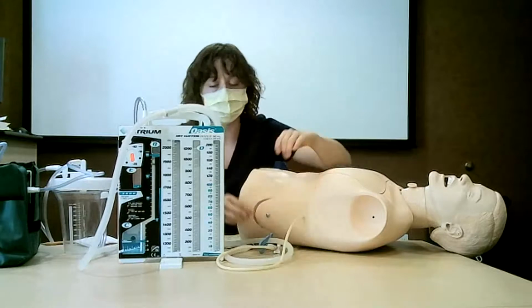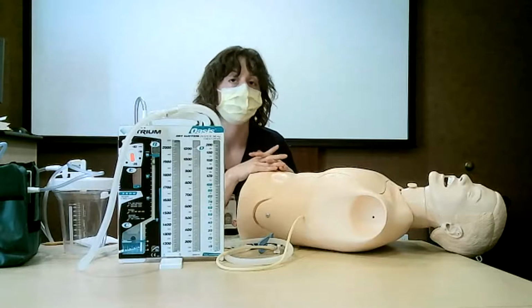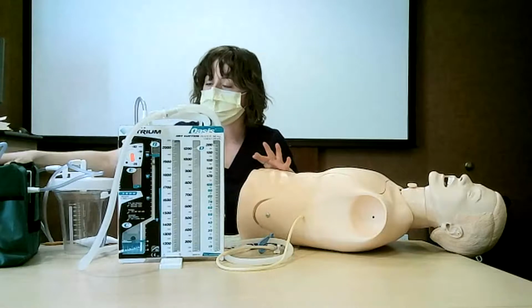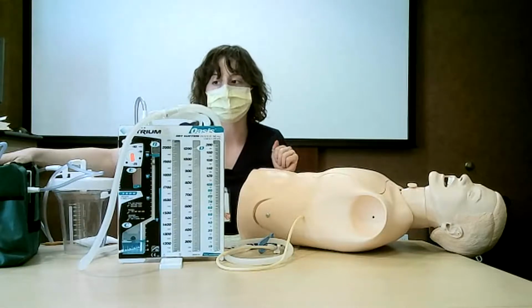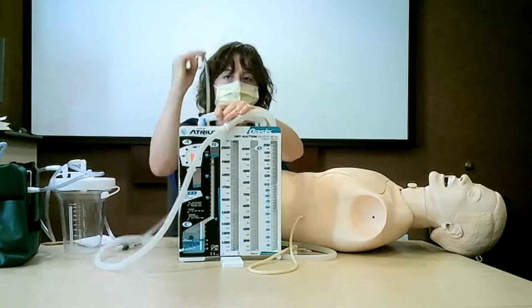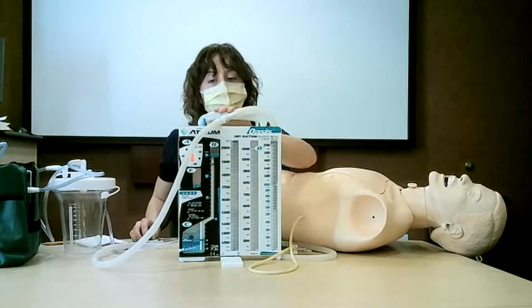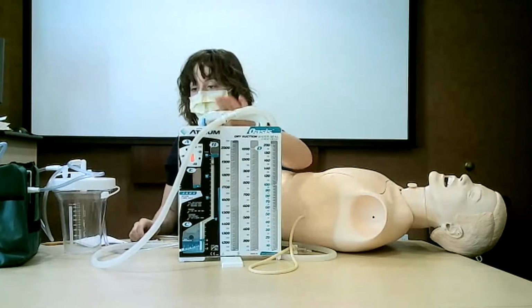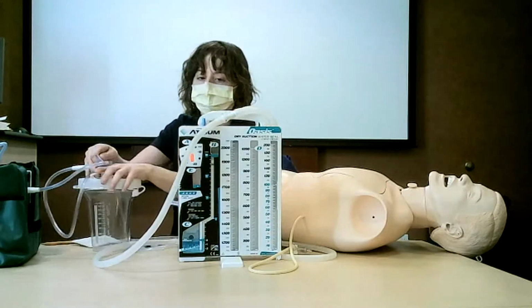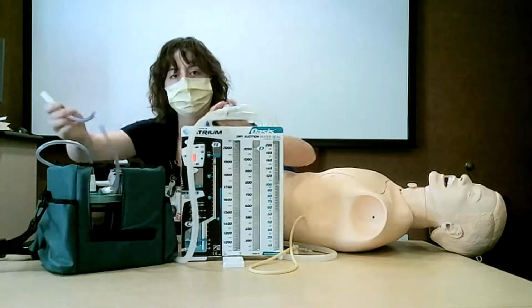Now, if you want to take your chest tube patient for a walk, you need specific orders that state the patient is okay to ambulate on water seal. If they're not, you will get a portable suction machine, but I'll show you first what water seal looks like. All that means is that you take the suction tubing off of the chest tube itself, and now the patient is free to move about as they please. If you do need to apply portable suction while they're ambulating, that looks like this.